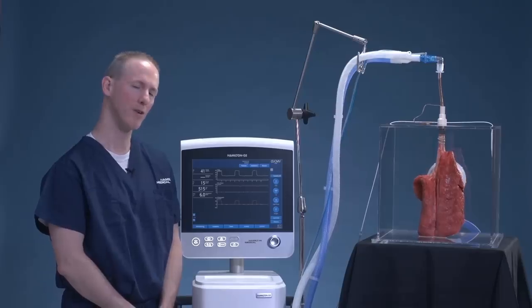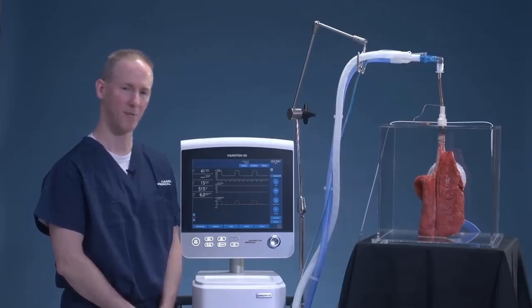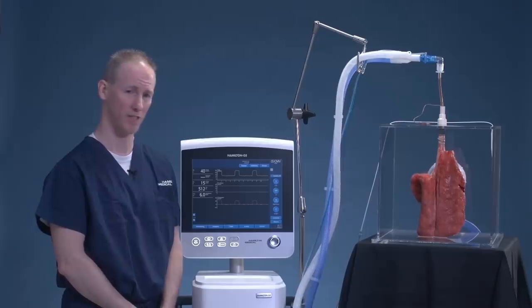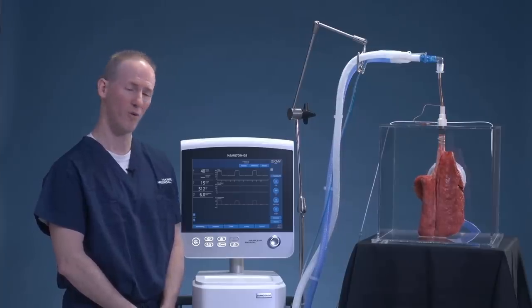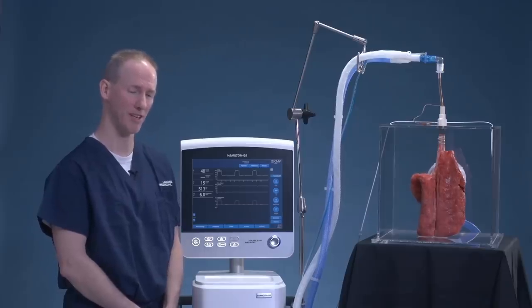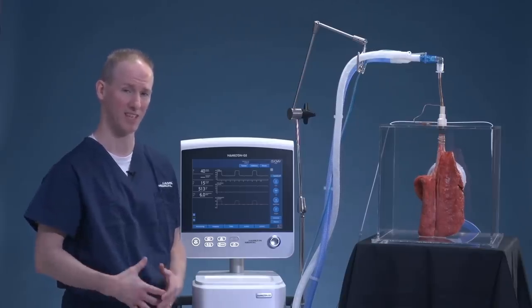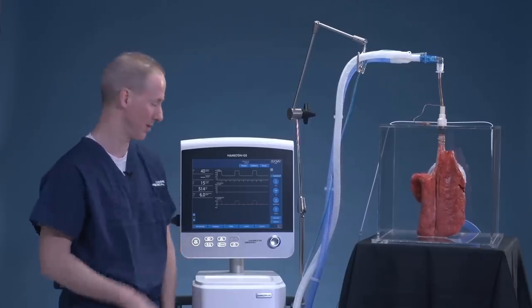We've increased our PEEP from 6 to 16 centimeters of water pressure, and while that is a 10 centimeter water pressure increase, our airway pressure actually dropped as we facilitated alveolar recruitment.